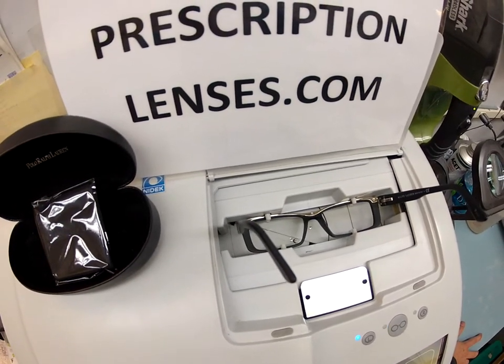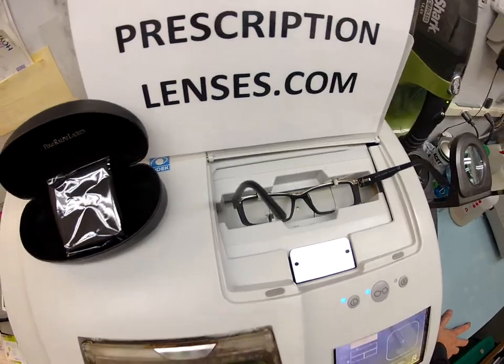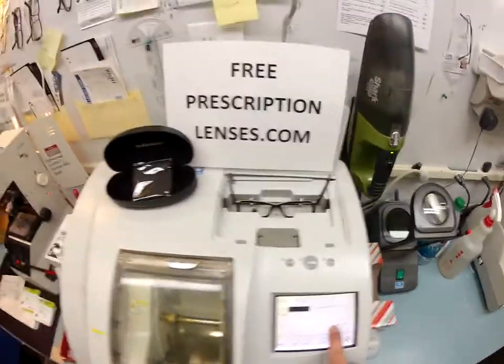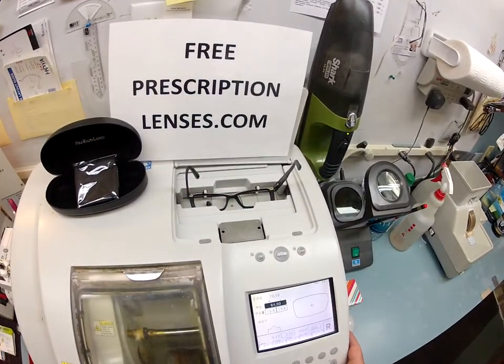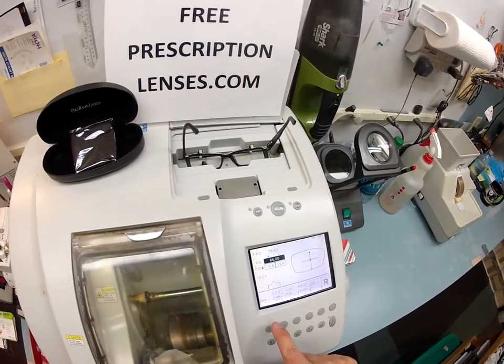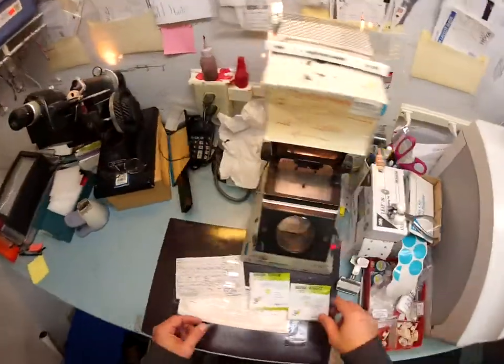You purchase the frame and you get high quality single vision lenses. So I'm going to pull the shape of your lens up. I'm going to put in your pupillary distance which is 66. I had to get on my tippy toes to measure that — you're so tall. I have polycarbonate lenses for your frame. Let's go ahead and get started.